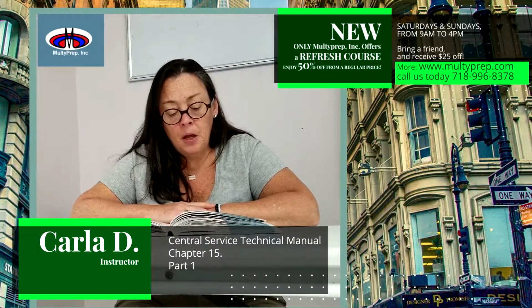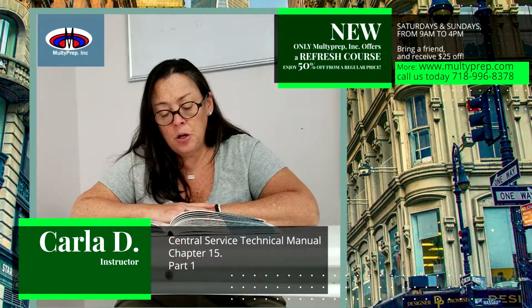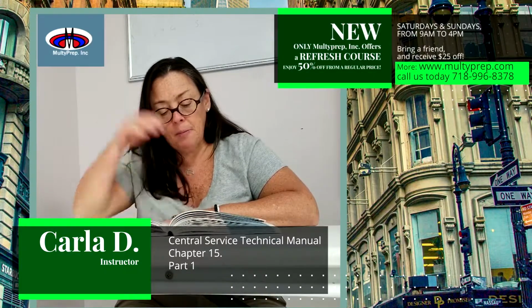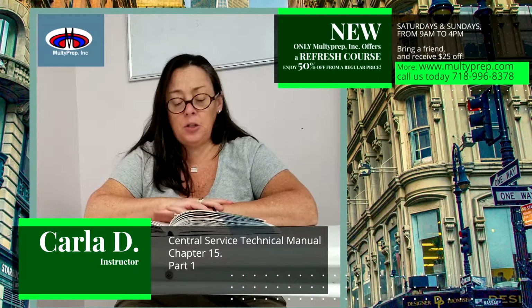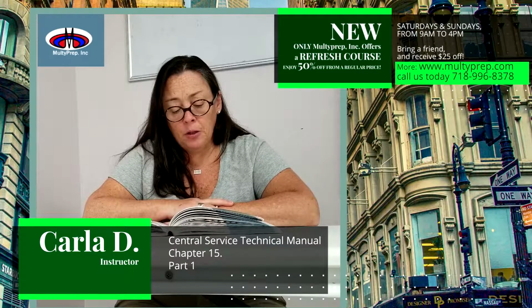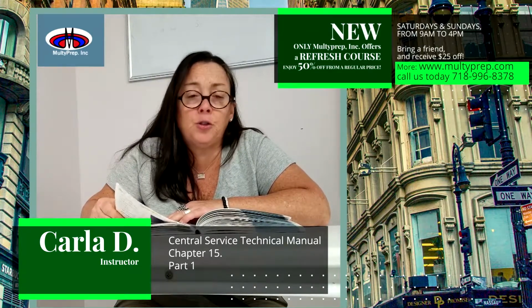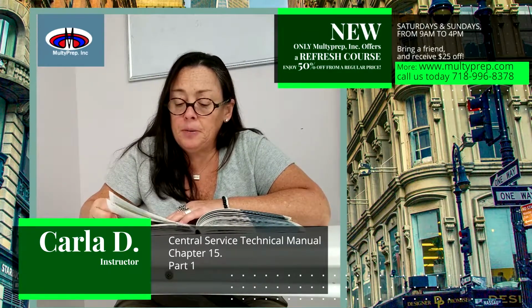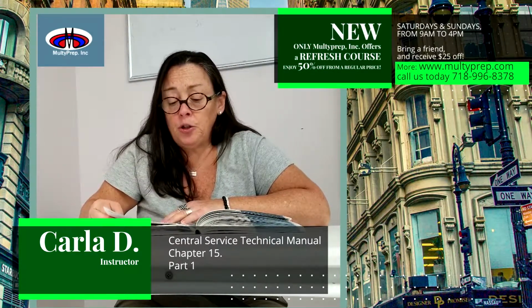Safety. Chemicals used as sterilants are designed to destroy a wide range of pathogens. However, the same properties that make them effective sterilants also make them harmful to humans. In particular, with sterilization methods such as EtO, or ethylene oxide, significant toxic residues can build up in the medical devices and packaging. To ensure a safe work environment, low temperature sterilization systems should be used according to the manufacturer's instructions, and appropriate work practices, engineering controls, personal protective equipment, PPE, and monitoring should be employed.